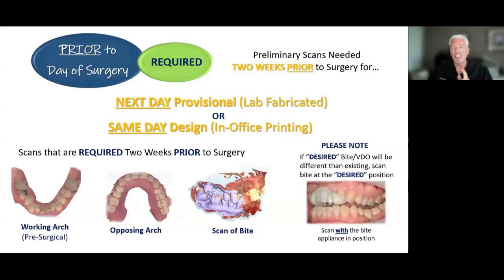That's where people make a mistake: they don't think about that, and they just come in. A lab can do a great job making you guides and great provisionals on the day of surgery, but in a couple of days that patient's going crazy because they're just not ready. They feel like they're too open, and you start pounding on these freshly placed implants, for lack of a better term. Sorry, I got long-winded on that topic.